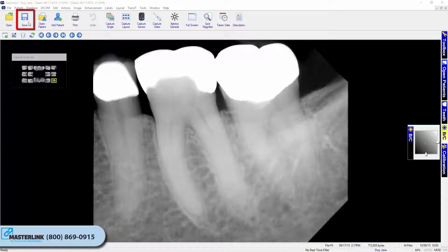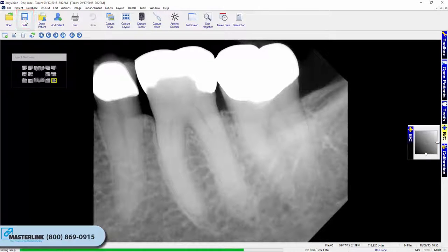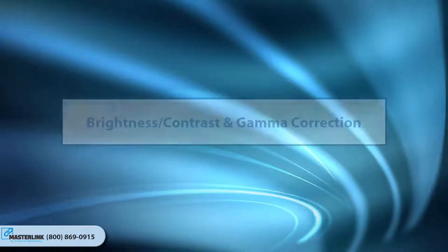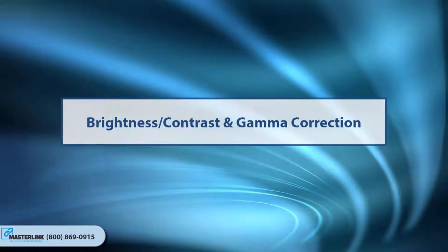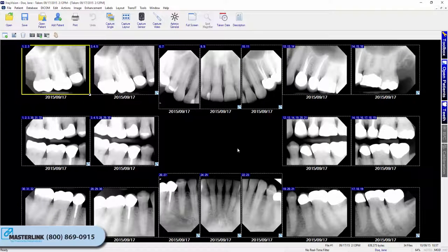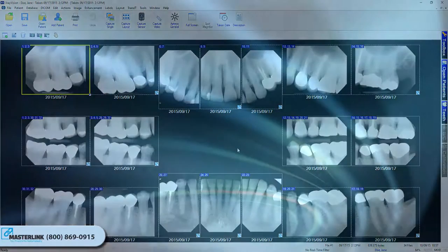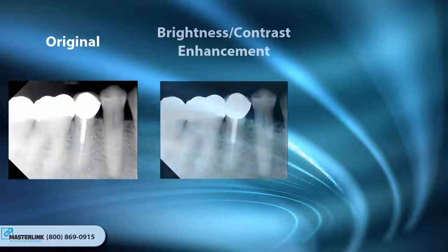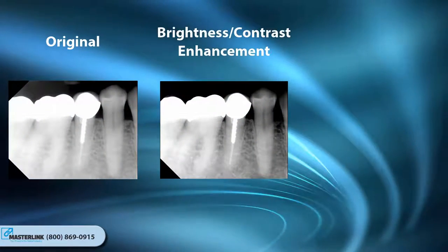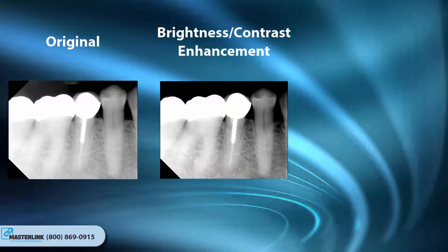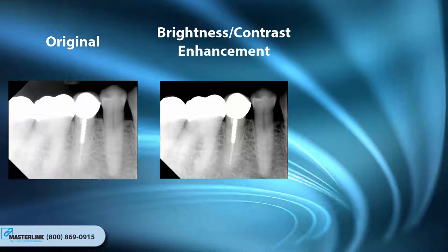On the main menu, click on the Save button to store the changes. Brightness Contrast and Gamma Correction. X-Ray Vision contains a standard Brightness Contrast and Gamma Correction utility that can be used to improve image quality. Brightness Contrast Enhancement adjusts the brightness and contrast of an image in order to improve the overall dynamic appearance of the image.